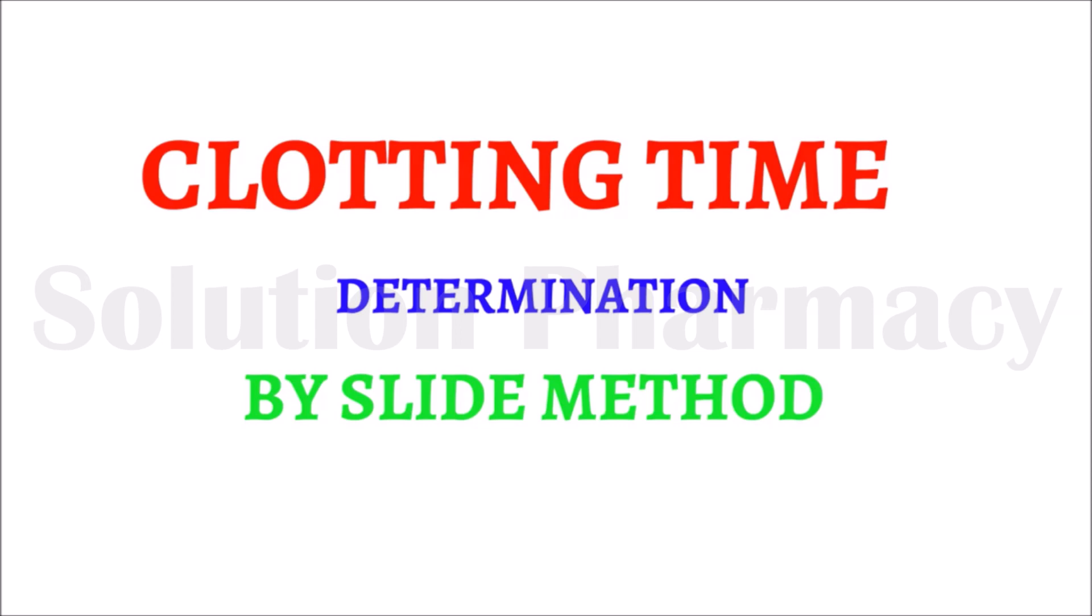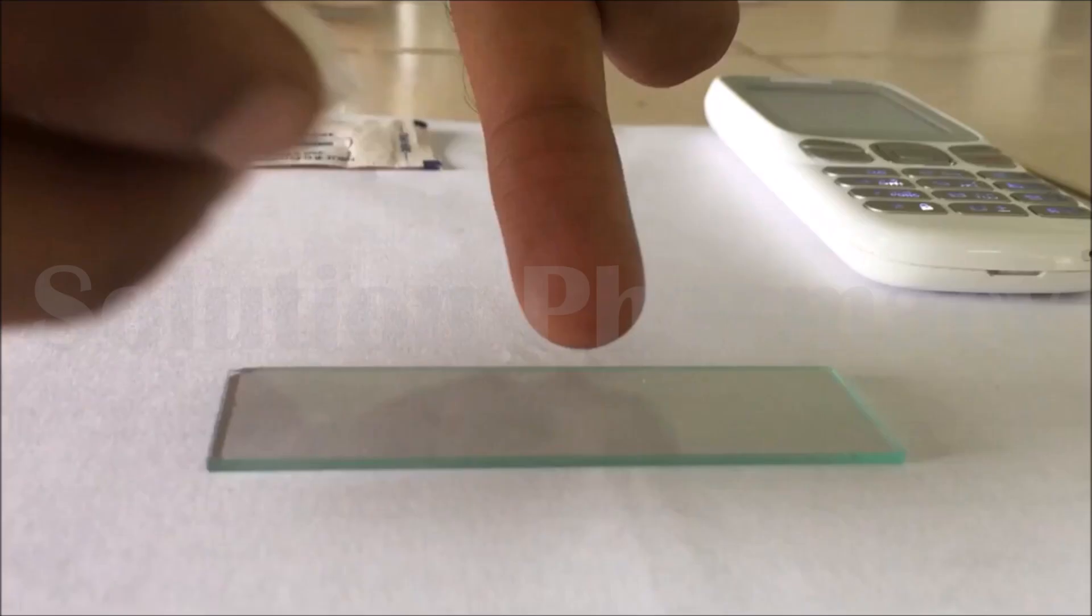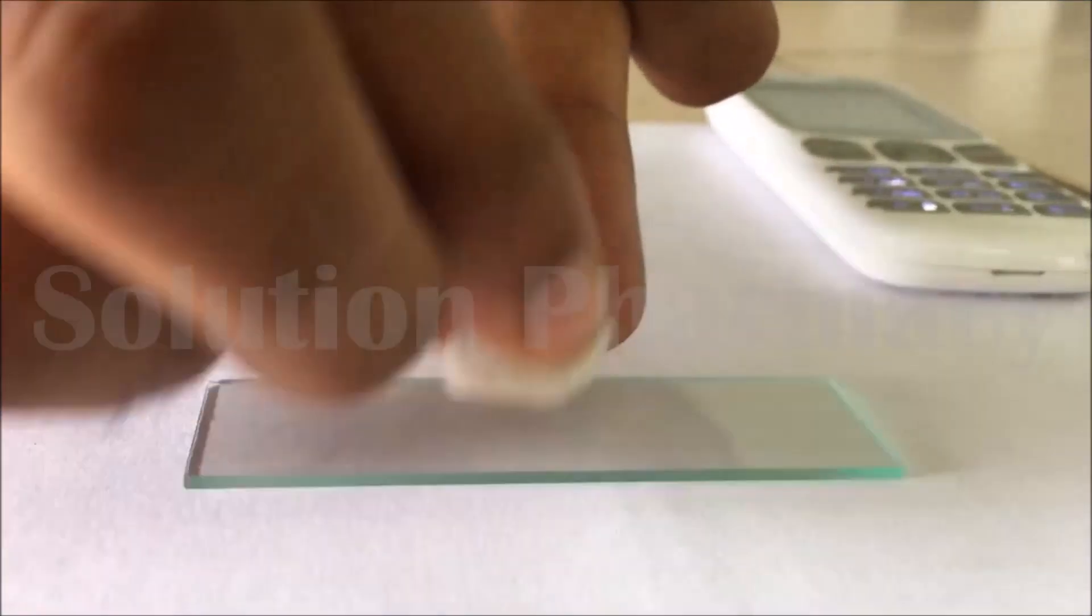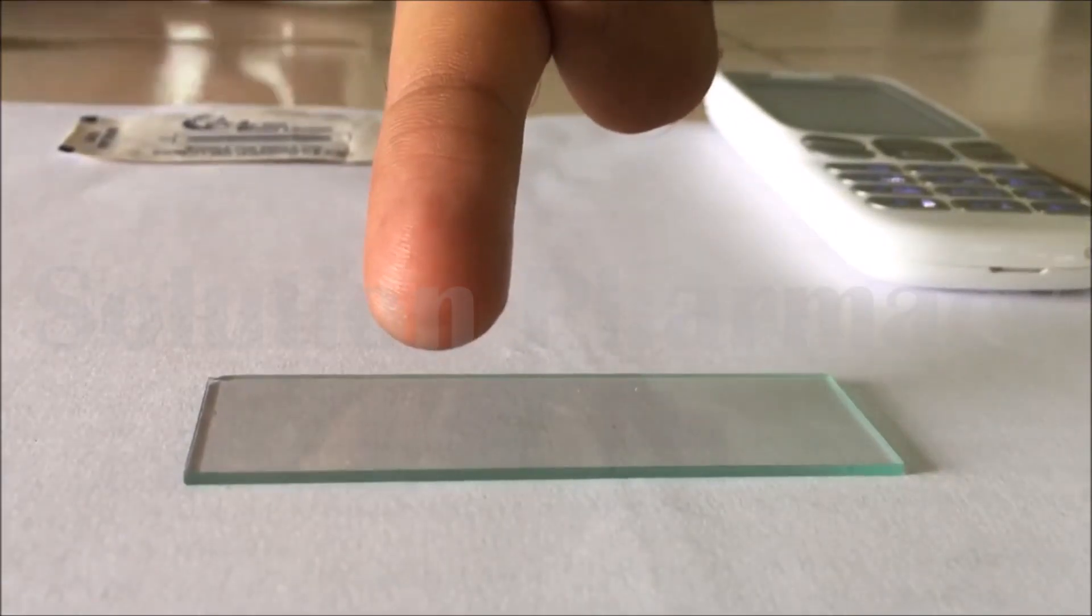For determining clotting time by the slide method, first sterilize your fingertip with ethanol, usually 70% ethanol, with the help of cotton swab. You can also use other suitable antiseptic to sterilize your finger.